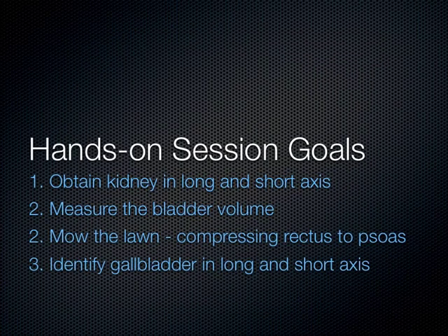Finally, this is the last slide. Just today during the hands-on session, what we're going to do is get the kidney in the long and short axis, okay? I don't necessarily need you to measure the bladder volume because that takes a little bit to stop and drop calipers and stuff. You can drop a caliper too if you want, but I want you to demonstrate how you would do it at least to the instructors.